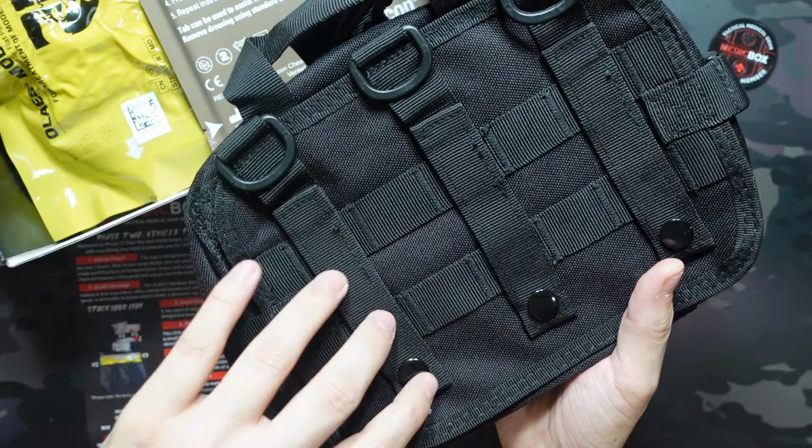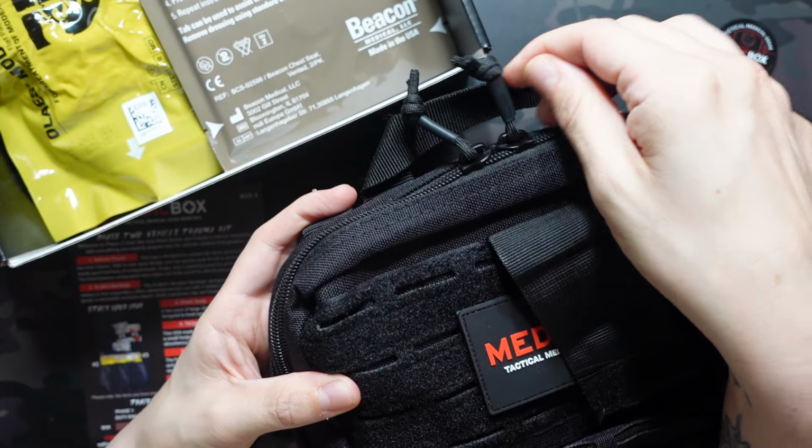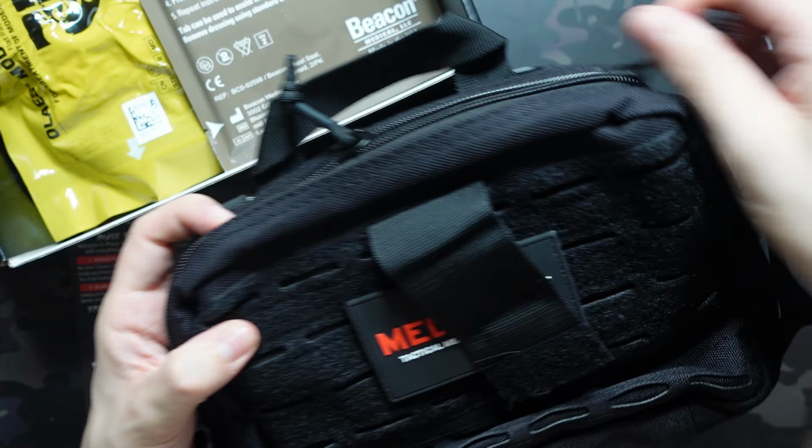And so secured at the top with the Velcro strap as well that I already have undone here was covering these zippers, which have paracord and that tubing on there to keep them nice and silent and easy to grab onto as well.